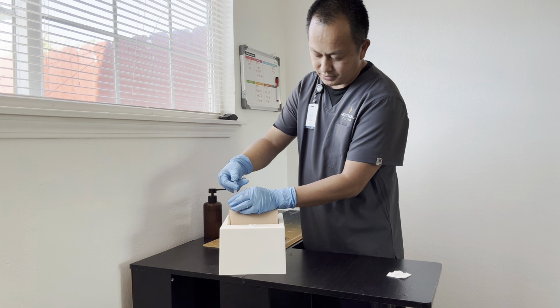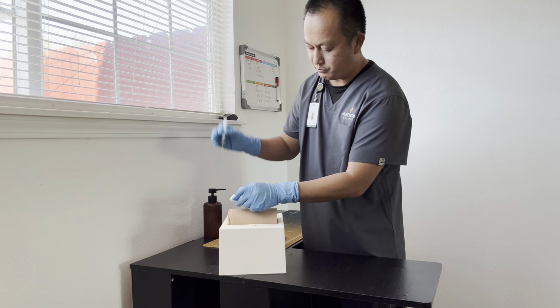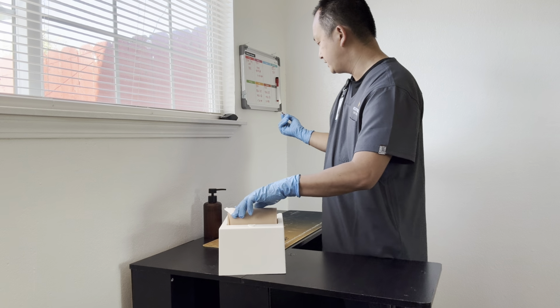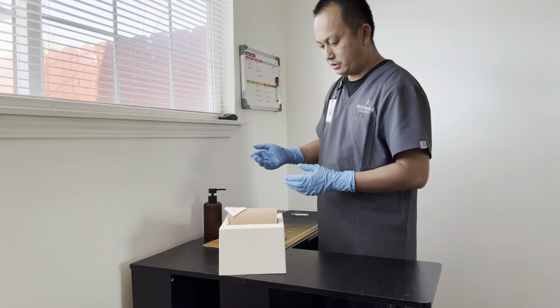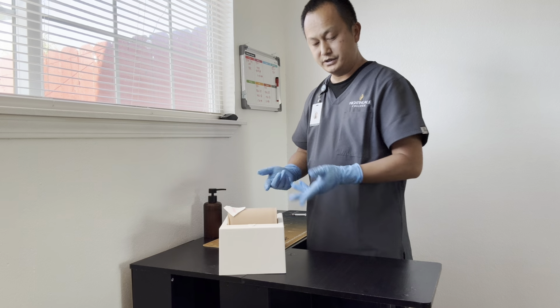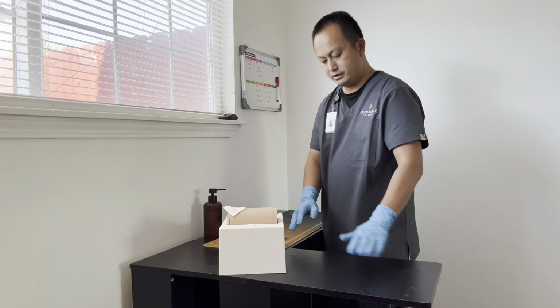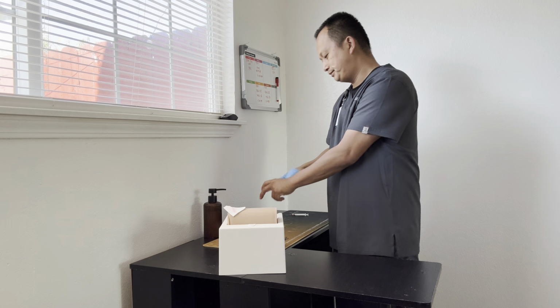Once the additional 10 seconds is up, we're going to grab our gauze here, remove our needle quickly, and then gently apply our gauze on top of the site. Toss away our sharps into the red sharps container, and then we're going to check our site to make sure there's no bleeding. If I see any bleeding, I will put a bandage on it. I will clean up my station here, and then remove my gloves.